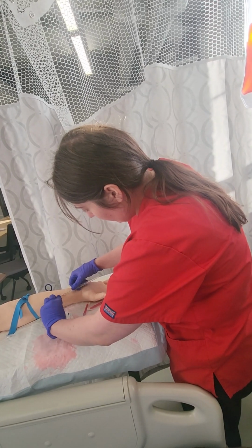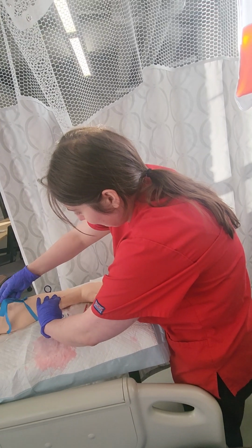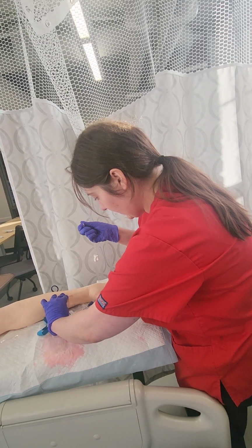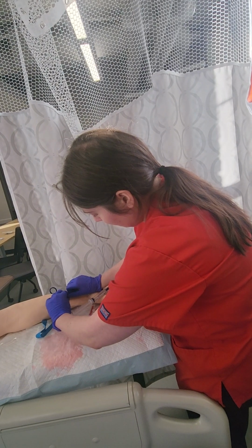And I'm going to compress that. Release that. Releasing the cap on this. Okay.